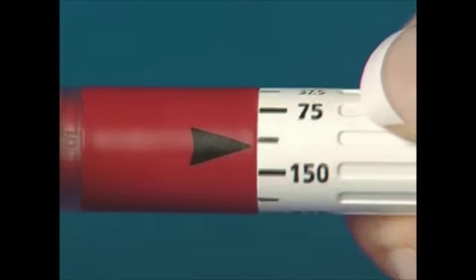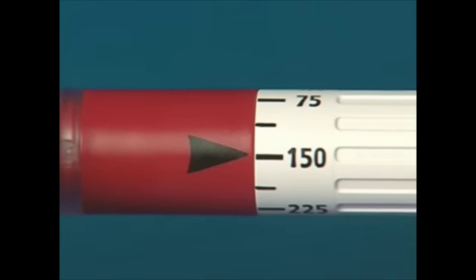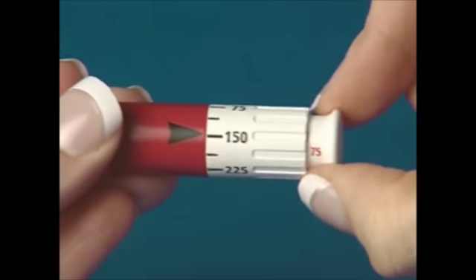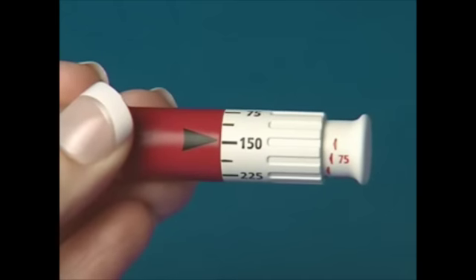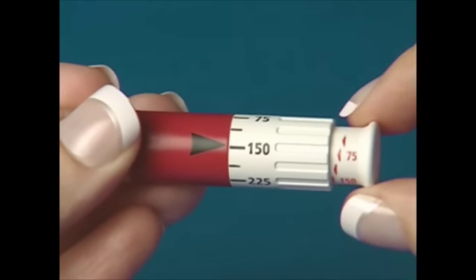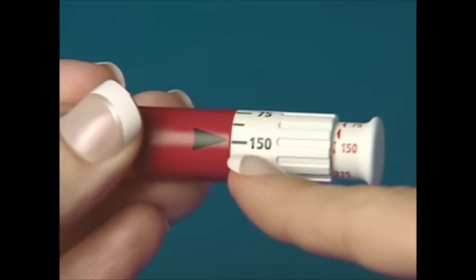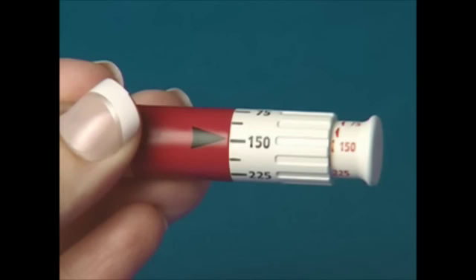Turn the dosage dial so that your prescribed dose lines up with the black dose arrow. Load the dose by pulling out the injection button as far as it will go. Confirm the correct dose by looking at the last fully visible red flat arrow on the injection button, which indicates the dose that is loaded and ready to be injected. If the last fully visible red flat arrow indicates a dose lower than your prescribed dose, it means the quantity of drug left in the pen is not enough to complete the dose. Use a new Gonalef RFF pen to complete the dose.